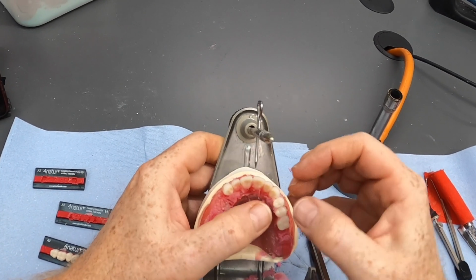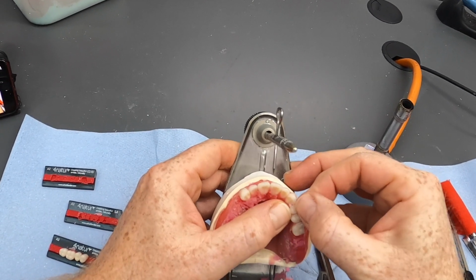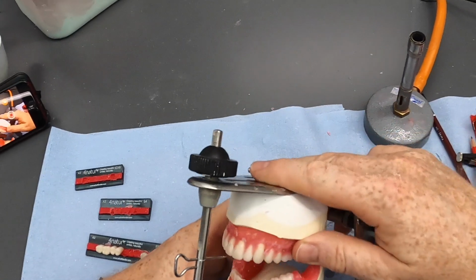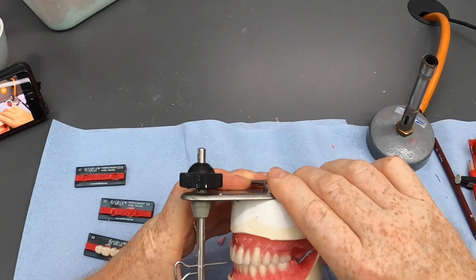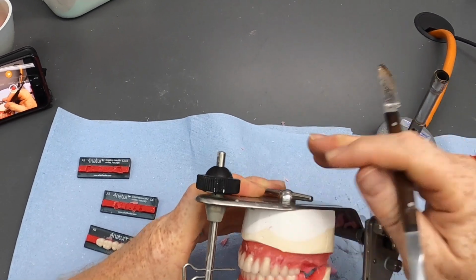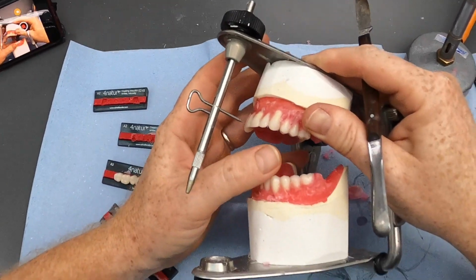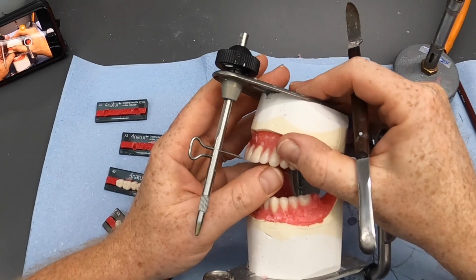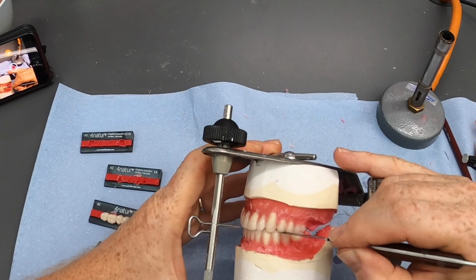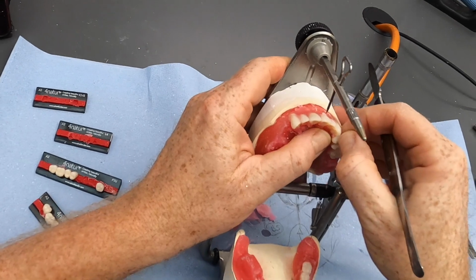Pop that in. And hopefully we've got some teeth nicely occluding. We'll do another video for lingualized occlusion, I think, at a later date. So I'm just going to straighten that one up a touch. Like so. Palatal cusp just needs to come down a little because it's not quite contacting.